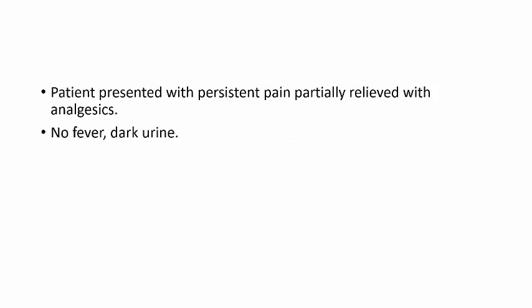A few days later, the patient presented with persistent pain, partially relieved with analgesic, no fever, dark urine. Second ultrasound. This is the importance of point-of-care ultrasound in the follow-up of your patient, because if any complication happens, you can catch it at the proper time and you can deal with it.